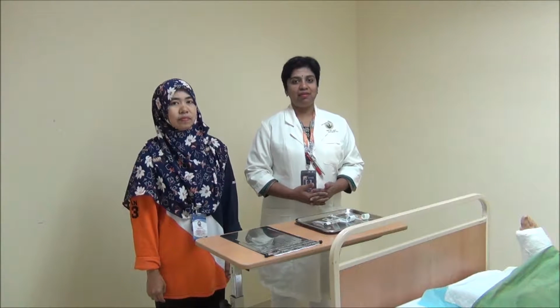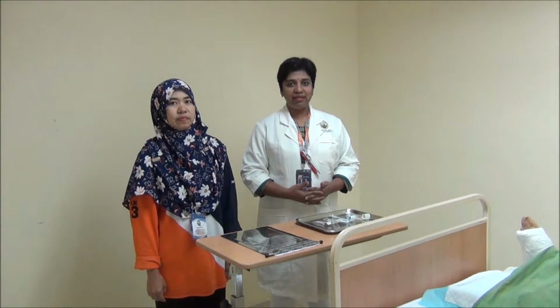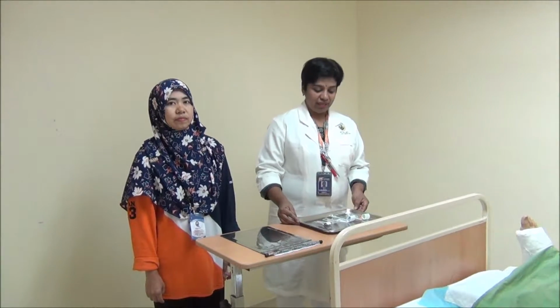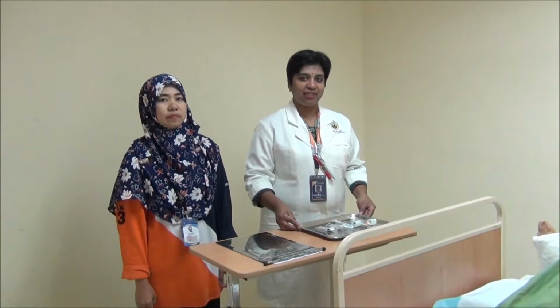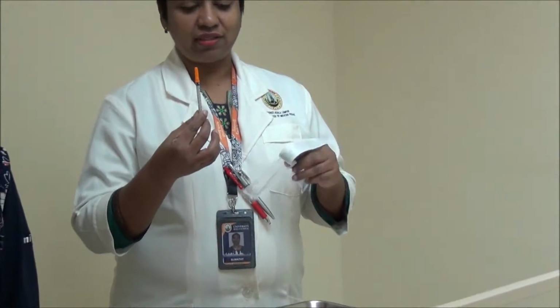Before we start the practical part of it, I would like to stress some of the basic principles of handling syringes and needles. First of all, in administration of subcutaneous injection, we have two types of syringes available. One is called the insulin syringe, which comes with the attached needle, and the other is called the tuberculin syringe, which comes without a needle.